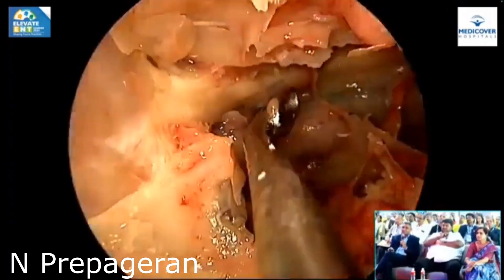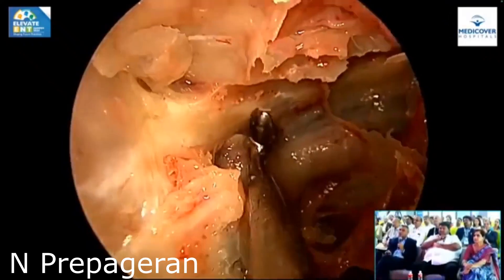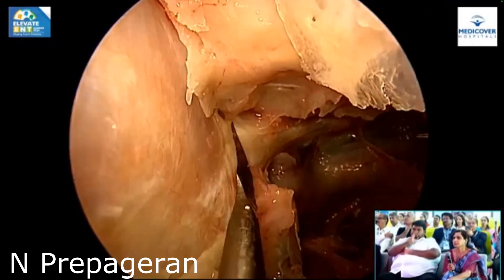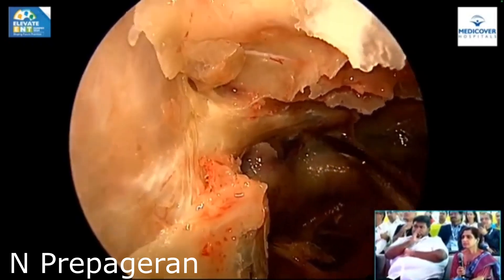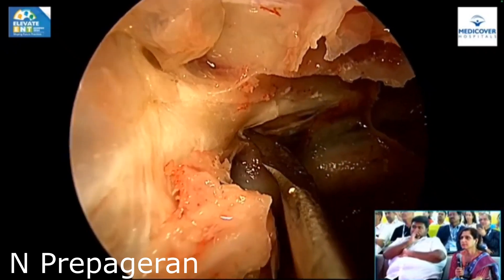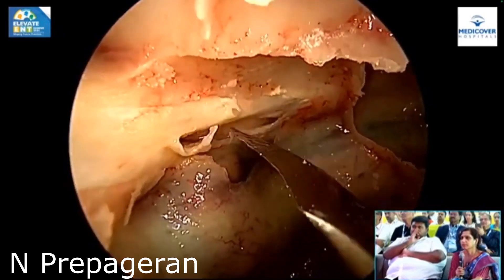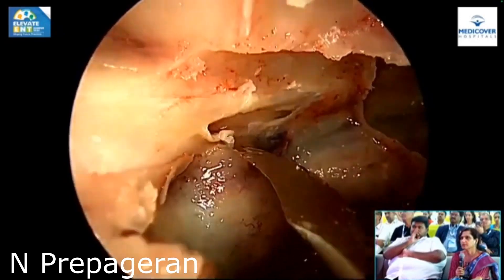Things decompressed all the way to where it enters intracranially to become the chiasma. So if you have optic neuritis, which means there's edema inside, then what we do is we cut the perineural sheet. Can you see the optic nerve? Can you see how thick the perineural sheet is? It's very difficult to damage the optic nerve — see how thick the sheet is.